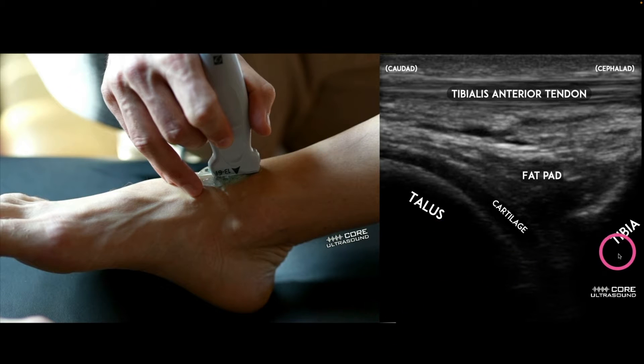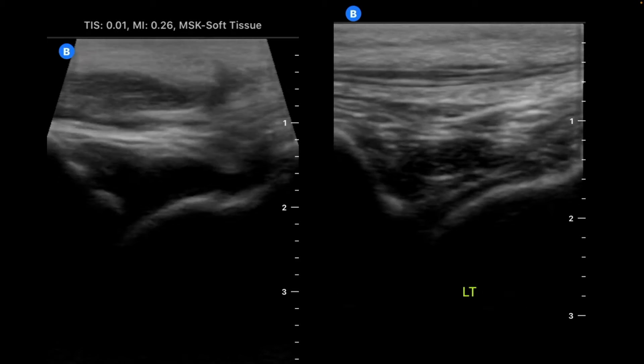Here we see the talus, the tibia, some cartilage — that's what this hypoechoic area is right at the end of the talus — a fat pad here, and the tibialis anterior tendon, more superficial. The joint is everything below this tibialis anterior tendon, and that's where we're going to look for an effusion.